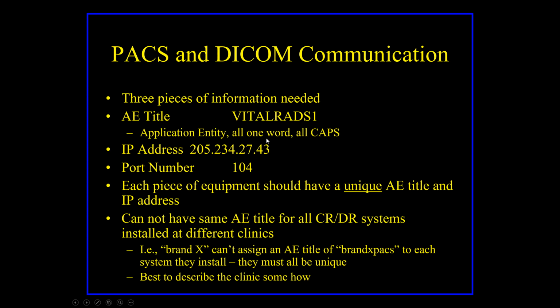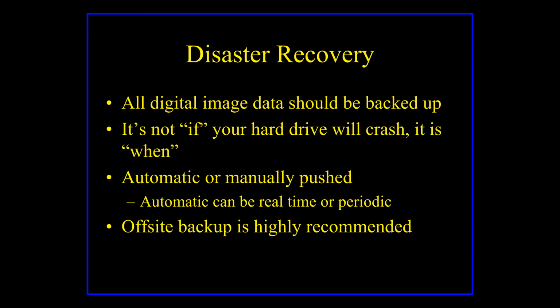If you have those 3 pieces of information, if I call a radiologist that's in France, and I want to have him look at these dogs' images, all I have to say is, can you send me your DICOM information? He'll send me this, that, and I can set my machine up to send them to him. Okay, and it will go flawlessly. And not only does it send the images, all of the patient's information goes with it. It's really cool stuff, but you have to be a little weird to understand it or think it's cool.